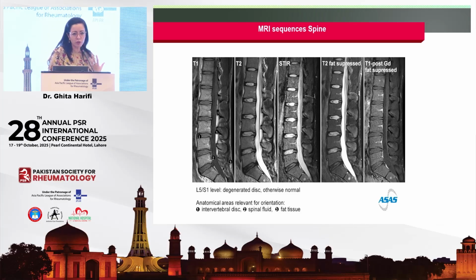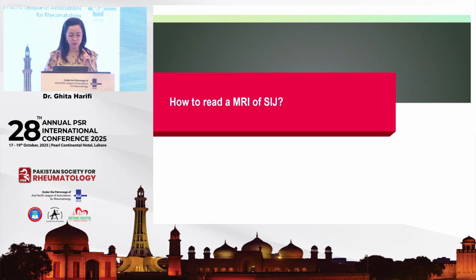We're not radiologists at the end of the day, and we need to be reminded of the basics of these sequences. This is a T1, how we recognize it: spinal fluid, black, and subcutaneous tissue, hyperintense. STIR: spinal fluid is bright, and subcutaneous fat has been suppressed and it's dark. So these are the two sequences that we'll have to deal with.